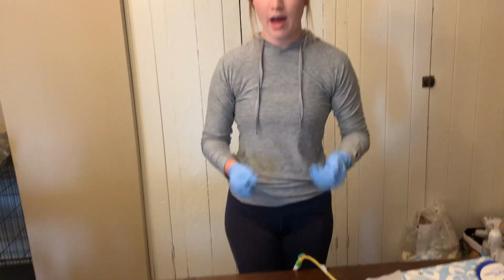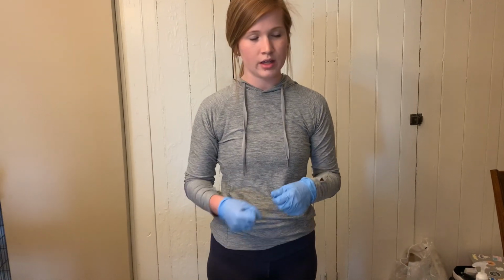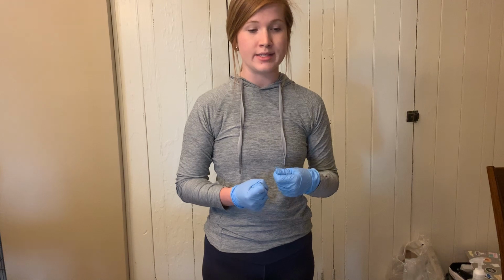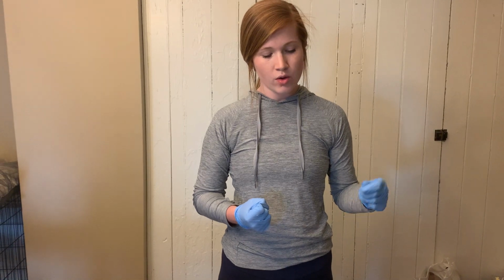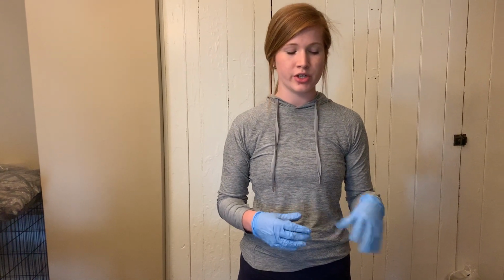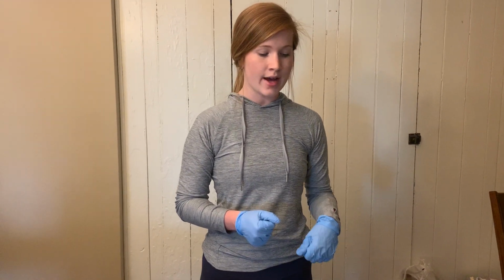Okay, so now that I have the catheter in, it's comfortable for the patient, and I have the collection bag hung, I would then provide any perineal care that is needed to cleanse any of the antiseptic or lubricant off of the patient. I would then also put them back into a comfortable position. You can unflex the knees and things of that sort, and also lower the bed back down.